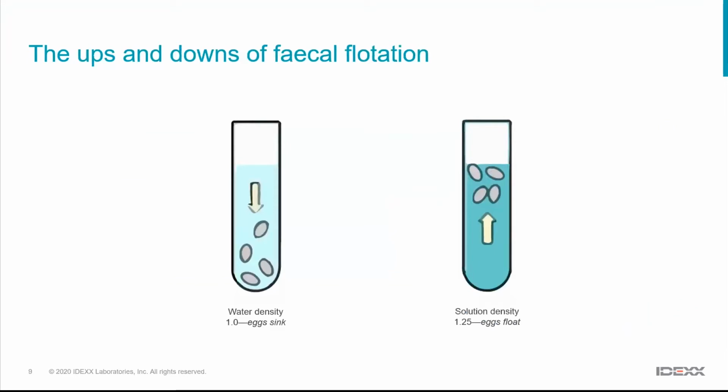Then I guess we look at things like a simple fecal flotation, so using the sugar or salt solutions that you're doing in-house. So we're often looking at things like the fecalizer, those ones in-house where you have the little device, you put some feces in it, you put the towel around it, put some of the solution in, mix it up, put the little filter in, fill it up to the top with the solution, put the cover slip on top, leave it 15 or 20 minutes, then get the cover slip off, put it on a slide, and take a look at that.